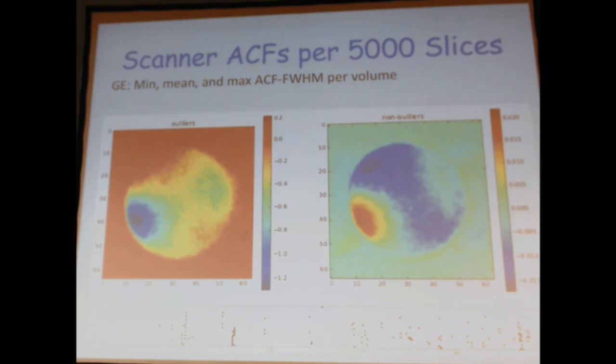But to my surprise, scanners appear to throw these weird little fits of instability, somewhat asynchronously and randomly across slices. GEs and Philips are a little more prone to do it, based on our experience, than Siemens, but virtually every scanner does it at some point. And the percentage changes are sufficient that if there's enough of them, they will potentially screw up resting state dynamics.